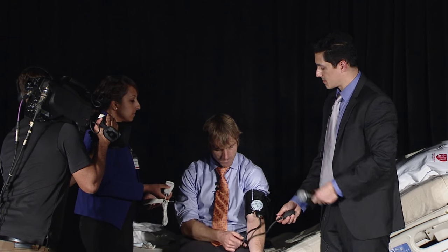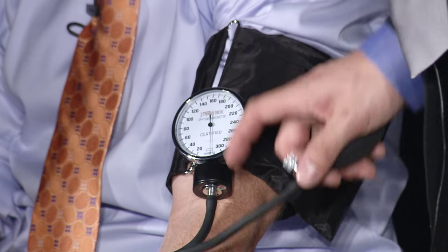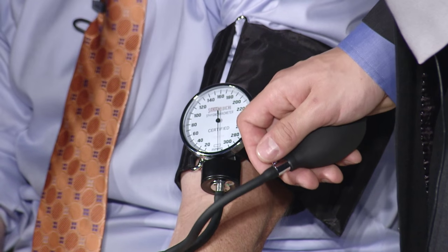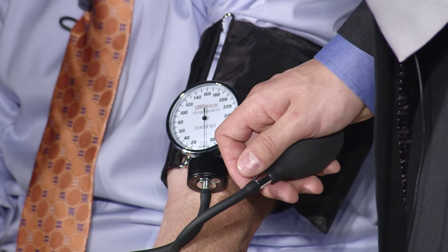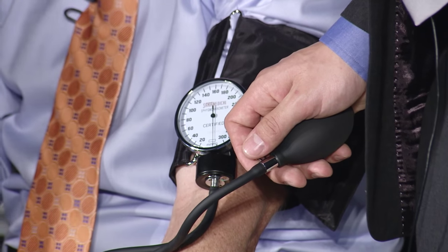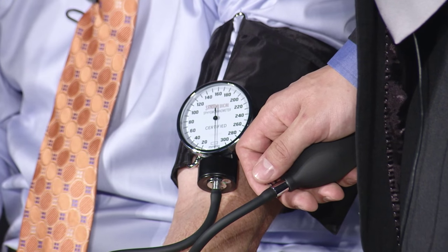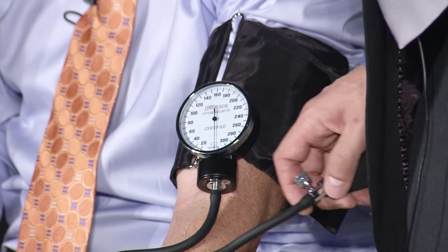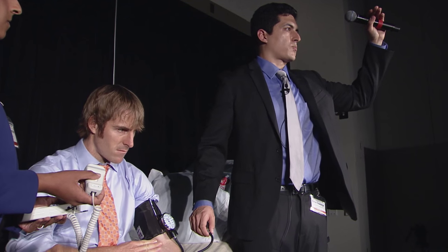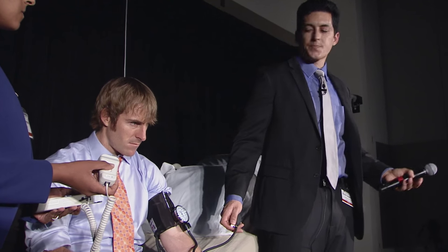First we're going to measure his blood pressure normally. What we're looking for is where the Korotkoff sound first starts to appear — and when you first hear it and then take a deep breath in, it should go away, because blood pressure dropped a little with that deep breath. Then we keep going down by fives to the point where the sounds are consistent despite breathing. The difference between those two readings should be less than 10 millimeters of mercury. That's normal.